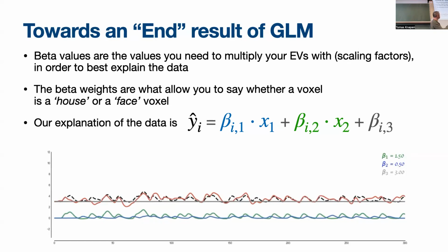And so what this analysis does is it tries to establish how much of the green and the blue I need to add together to produce the red, namely the data that I have. Does that clarify things? Yeah, so for this voxel, you get those scalars beta 1 and 2, that's the ratio of the activation explained by each. Exactly.